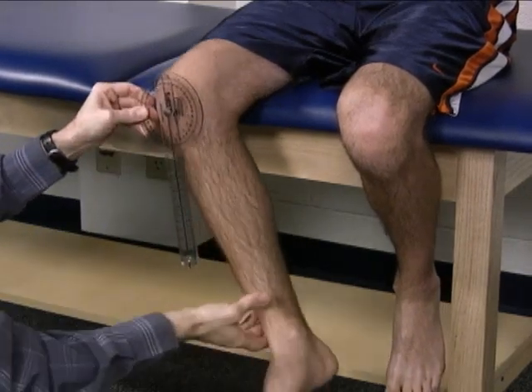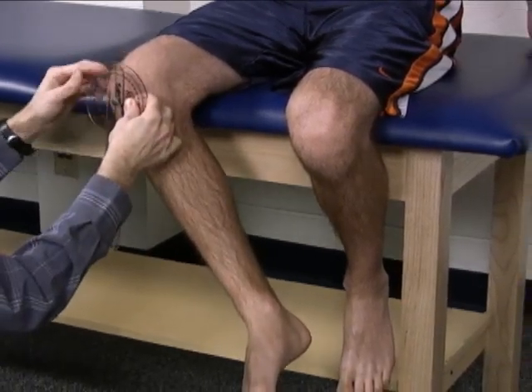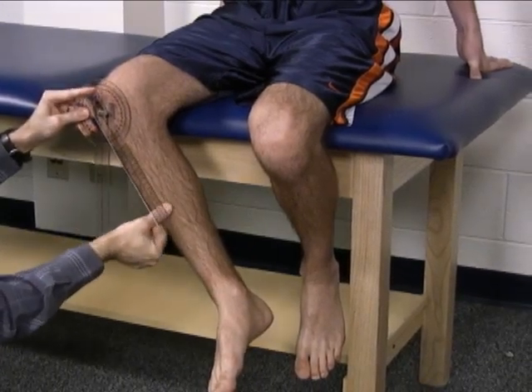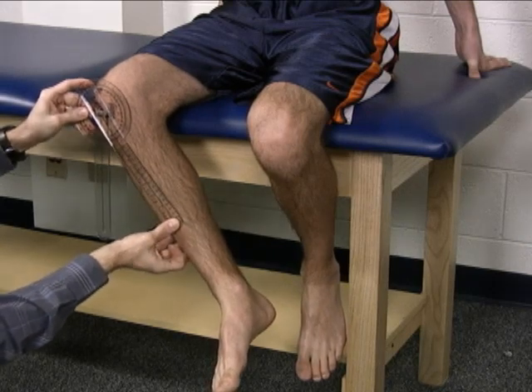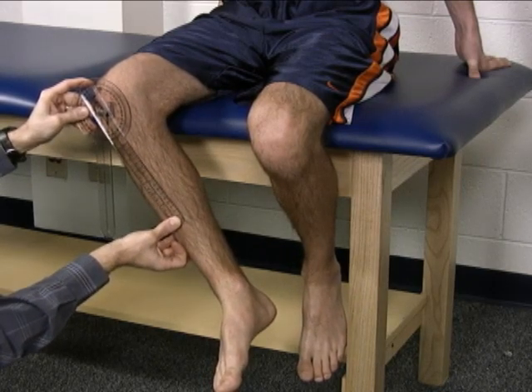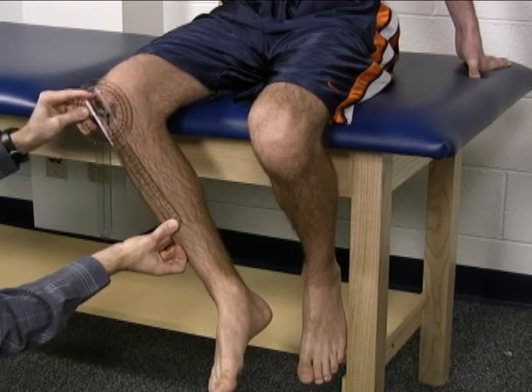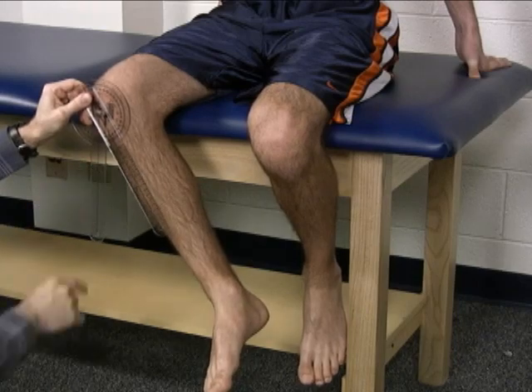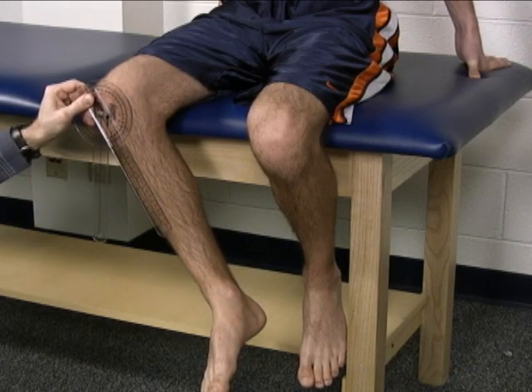Then have the patient externally rotate. Find that patella, line up your moving arm with that anterior ridge on the tibia, and make sure you eyeball your stationary arm to make sure it's right on. In this case, we have about 35 degrees of external rotation of the femur at the hip joint.